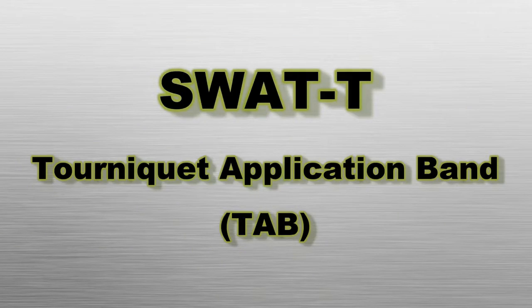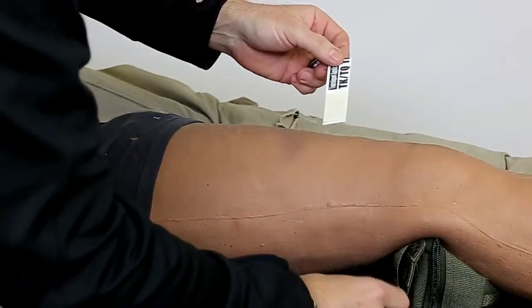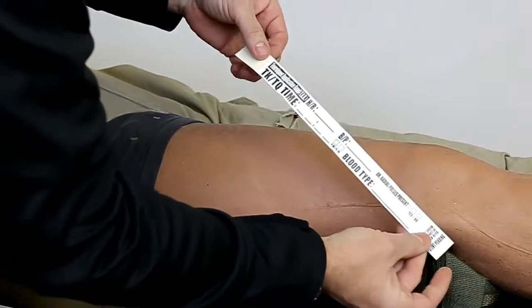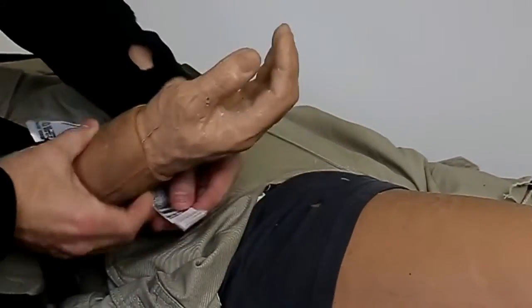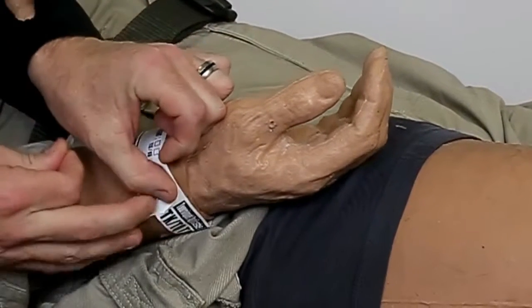The tourniquet application band is a patient information device located in the center of the rolled SWAT-T, which can be applied to the patient's wrist. Once bleeding is controlled, you may fill out the tab with appropriate patient care information such as tourniquet application time, heart rate, blood pressure, blood type, and whether radial pulses are present. Please note that transport of a critical patient should not be delayed solely to complete the tab.